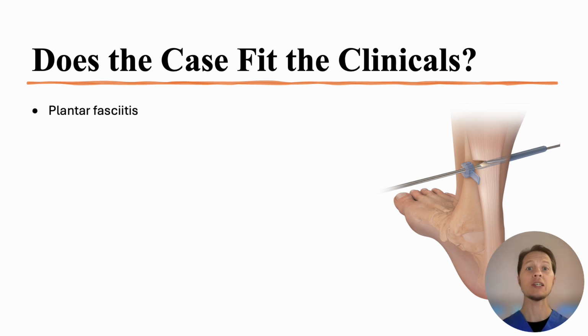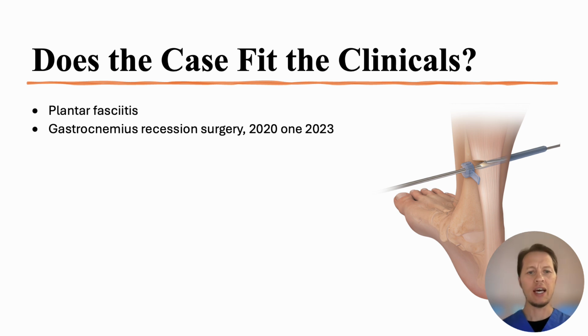Well, here we go. This is a guy that had plantar fasciitis, and he had bad plantar fasciitis. Oh, my feet are a mess. I've got horrible plantar fasciitis. Nothing's getting better. I need surgery. And he had, if you know this, a gastroc recession, and that's what this is basically highlighting here. Surgeons go in endoscopically and they just release the gastroc slash myotendinous junction fairly high up to allow more stretch. He had one done in 2020 and the other extremity in 2023.